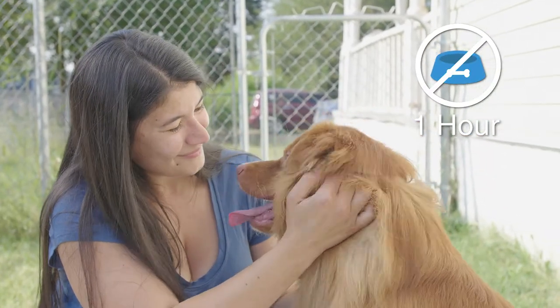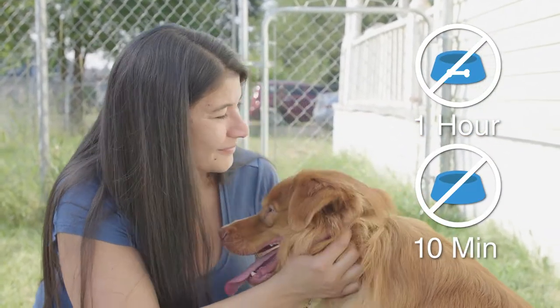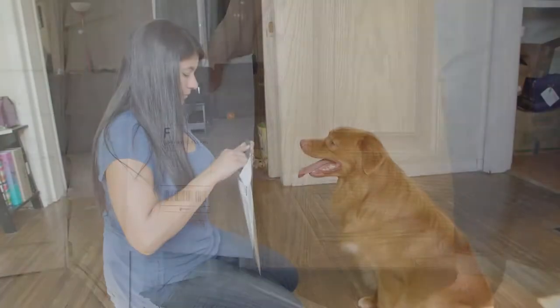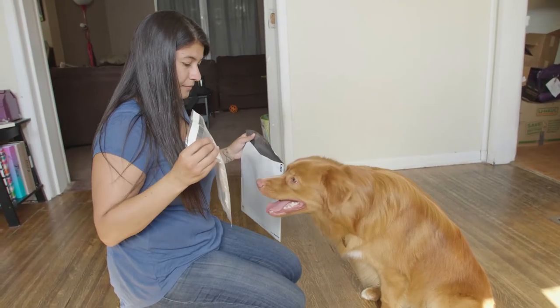Do not let your dog eat for at least one hour or drink for 10 minutes prior to swabbing. Also isolate the dog from other animals or toys to prevent cross-contamination.